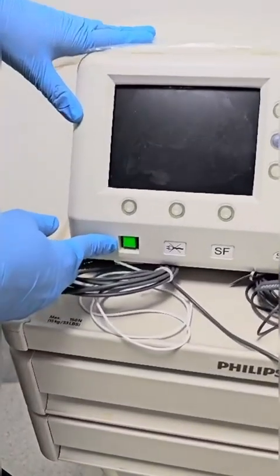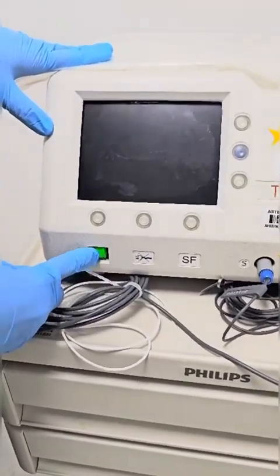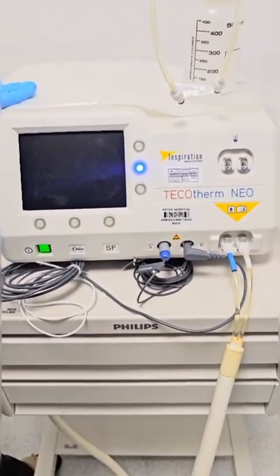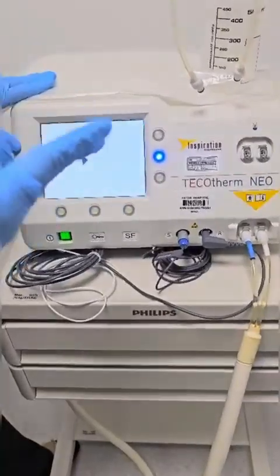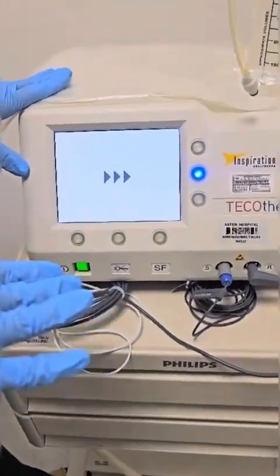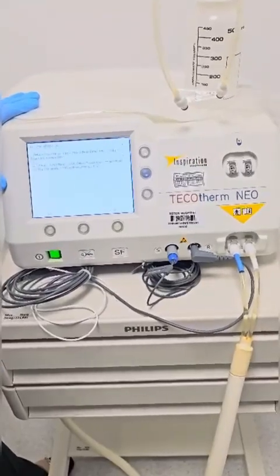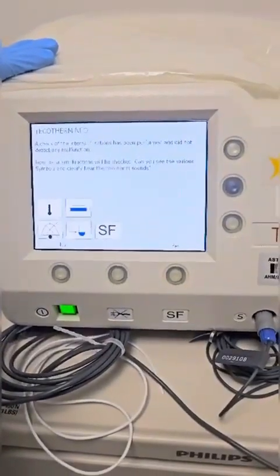The first thing we will do is make sure the power supply is connected and you can start from here. You can just switch on from here. When you switch it on, it will run a self-test. You will hear a single beep followed by three beeps, which tells that everything is final — the self-test is passed and all is good. This is the single beep and this is the three beeps.